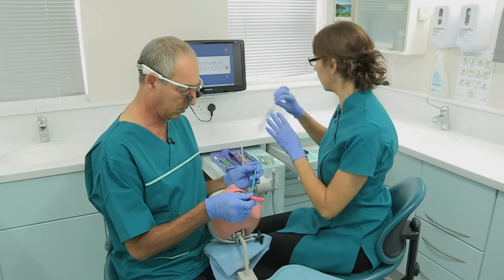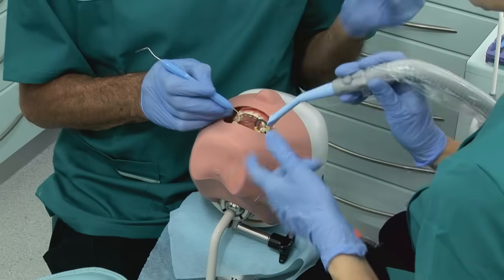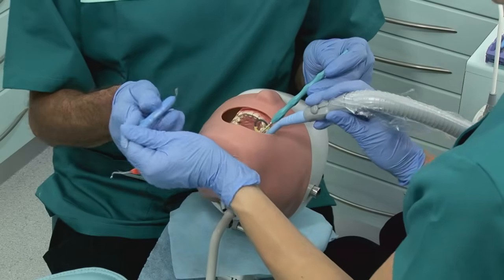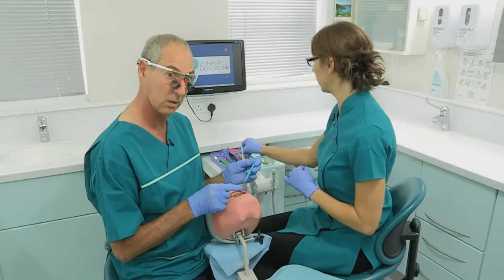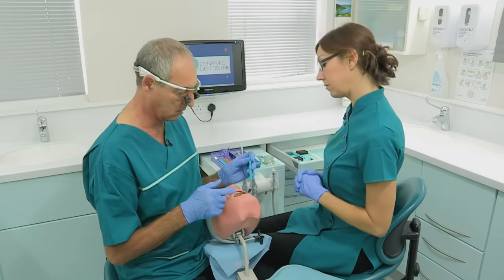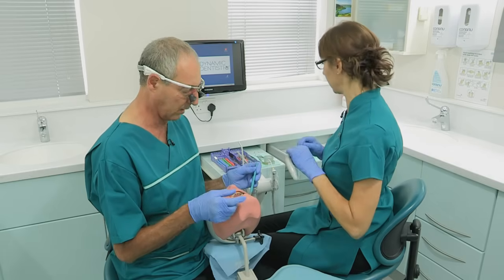Then I might have a probe. You'll notice that Sally's anticipating what I need in advance of me really needing it. And then we would take the band off in exactly the same way, which I'll demonstrate in a moment after using composites. So if it was a composite, again, whatever technique you use, we'll put some composite in, having done our etch, prime and bond already.